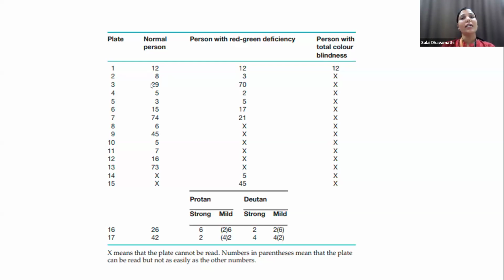Illuminance is very important, and distance is very important. Mostly everyone does it at 35 centimeters based on the near vision correction. That is wrong. For pseudoisochromatic plates, it is 75 centimeters. For HRR, it is 75 centimeters. If it is a D15 test, then it is 50 centimeters. So the distance varies, and you should keep that in mind when you are checking the isochromatic plates.